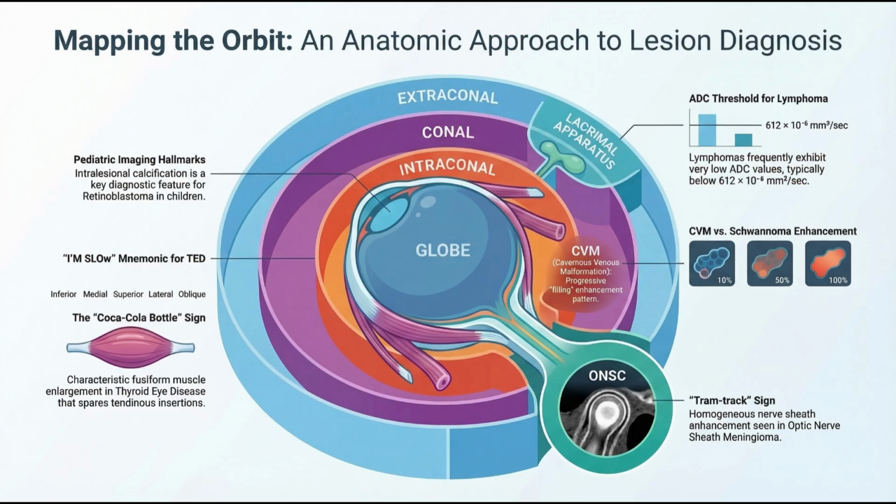Exactly. But how does that compare to the dangerous tumor? We have to contrast that benign, naturally shrinking lesion with rhabdomyosarcoma. This is an aggressive, malignant pediatric tumor. It grows incredibly fast and can quickly destroy the surrounding bone. How do they tell them apart? To tell them apart, radiologists use that concept of restricted diffusion we talked about earlier. Right, the trapped water molecules. Can you give us a good way to picture exactly why a tumor traps water?